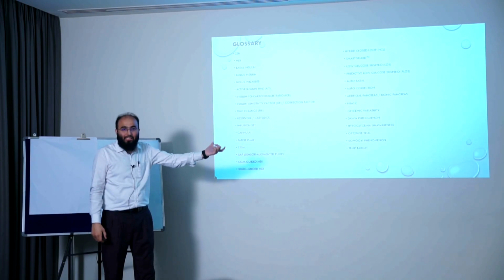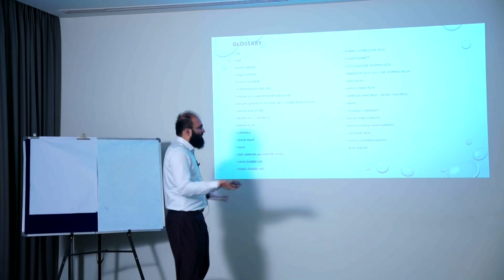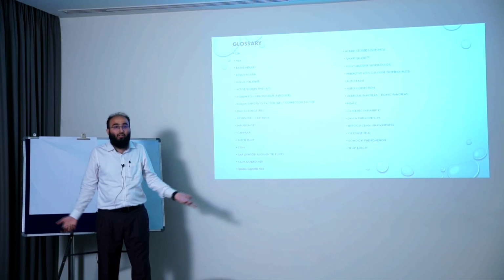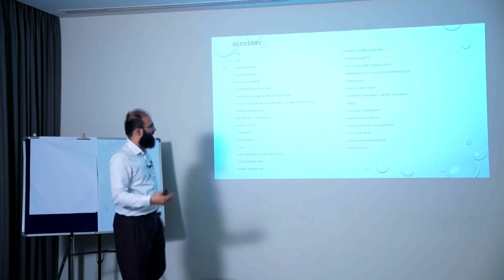And OPTIMIZE trial was OPTIMIZE 2. So in type 2 diabetes, insulin pump therapy, and it showed great results. Hypoglycemia unawareness is patient is having hypoglycemia, his sugar is say 40, he is not aware that his sugar is 40. So such patients, they benefit from CGMS and insulin pump also.